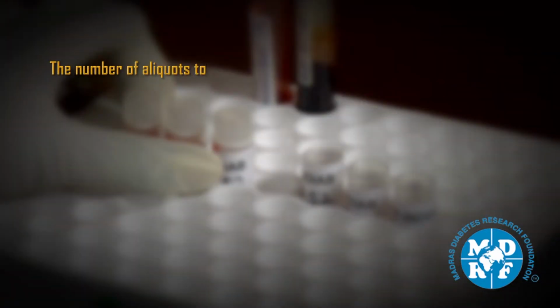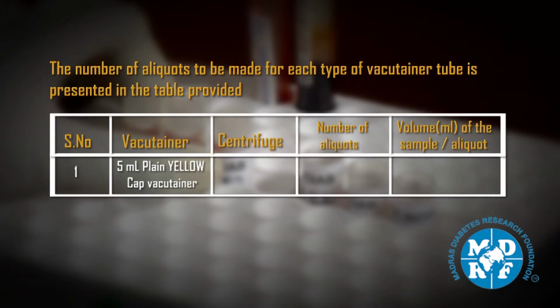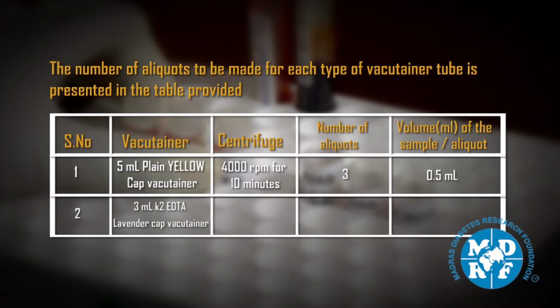The number of aliquots to be made for each type of vacutainer tube is presented in the table. 5 ml plain yellow cap vacutainer: 4000 rpm for 10 minutes. Number of aliquots 3. Volume of the sample aliquot 0.5 ml. 3 ml K2 EDTA lavender cap vacutainer: centrifuge not required. Number of aliquots 3. Volume of sample aliquot 0.5 ml.